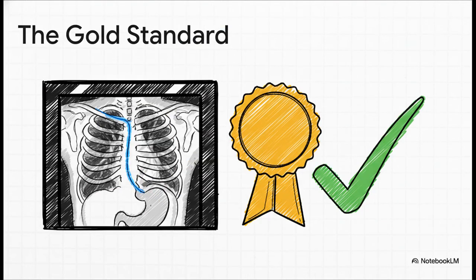An X-ray. That's it. It is the undisputed gold standard. An X-ray gives you a picture, black and white proof that removes every single shred of doubt. Before you put anything down that tube for the first time, this is how you get that 100% certainty.